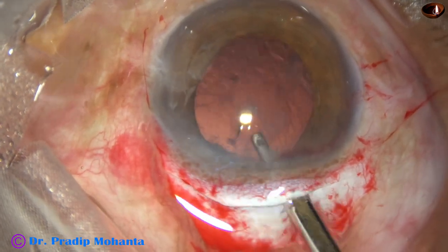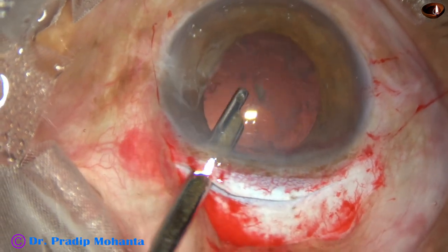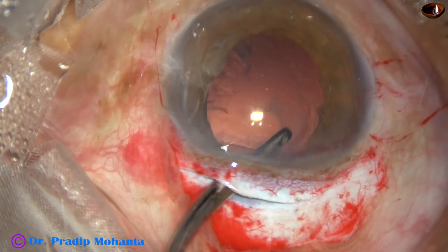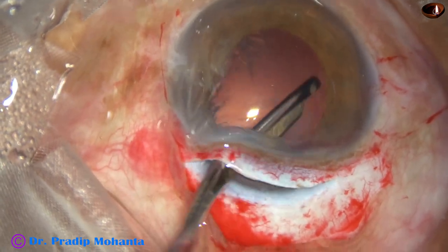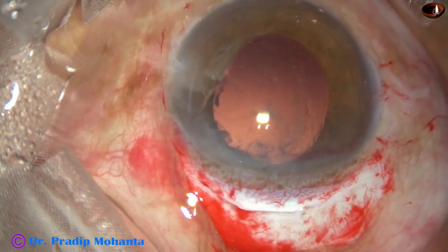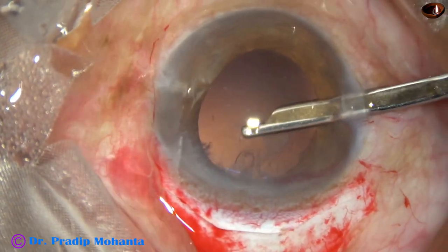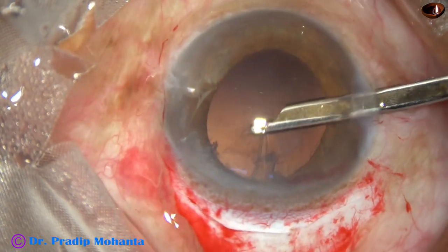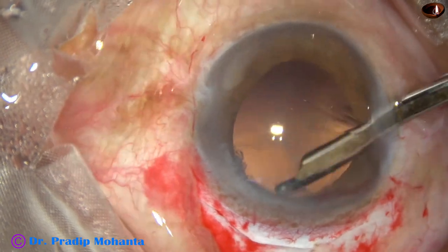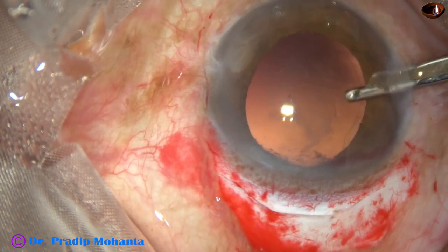And now I remove the cortex and the lens matter with the help of this Simco cannula. There is some fibrosis in the periphery of the posterior capsule. This will not cause any disturbance in vision. We are having very good red glow, so we hope that the retina is okay.